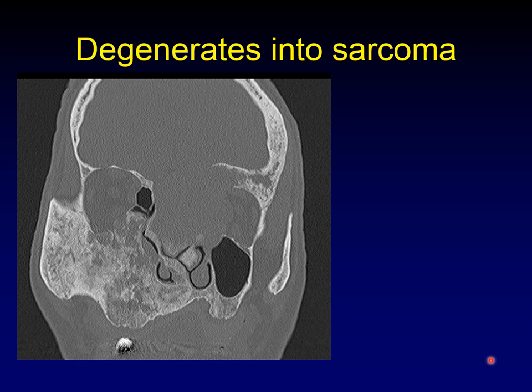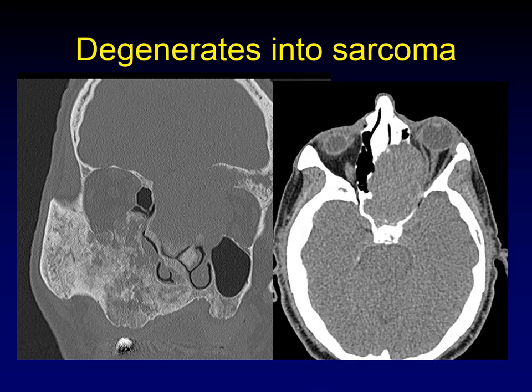One of the problems with fibrous dysplasia is that it can de-differentiate into sarcoma, either osteosarcoma or chondrosarcoma. You can see fibrous dysplasia all through the mid-face, but what's concerning are these erosive areas where the cortex just dead-ends into an erosive mass. This is uncharacteristic of fibrous dysplasia itself, and when you see an aggressive mass in the setting of fibrous dysplasia, you need to become concerned about degeneration into sarcoma.